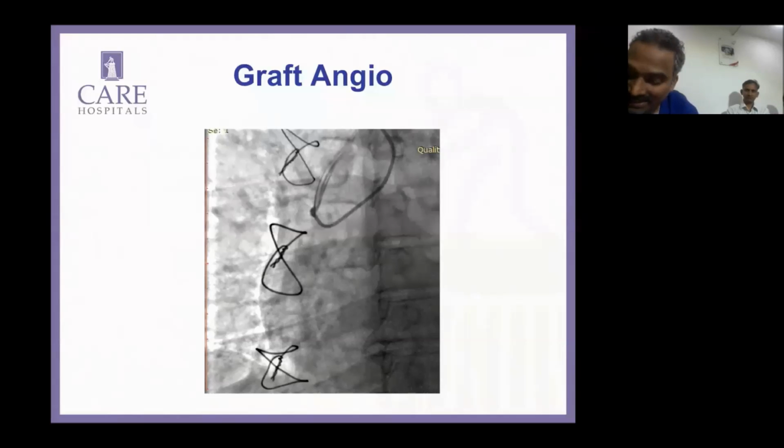That's the first thing. And second, if we have videos, see, we analyzed in the last session a few videos of my patients like that, where I couldn't hook grafts, but I could take native vessels. There, one sign which we can observe is a competitive flow. If there is no competitive flow in distal coronaries, I just say all the grafts are gone. Yeah. But we have static pictures here. I think it is very difficult to analyze that.